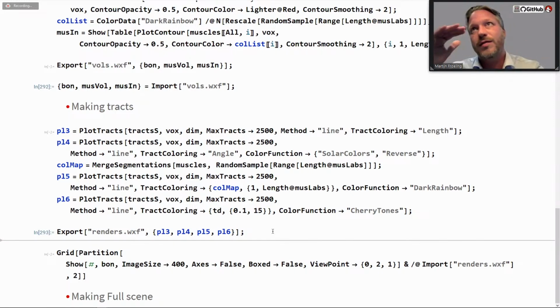So the length of the leg is, of course, 1 meter, and the resolution we're actually acquiring the data at is in the order of 6 by 1.5 by 1.5 millimeters. So we have typically between 1 million and 1.5 million data points in our leg where we actually sample everything.